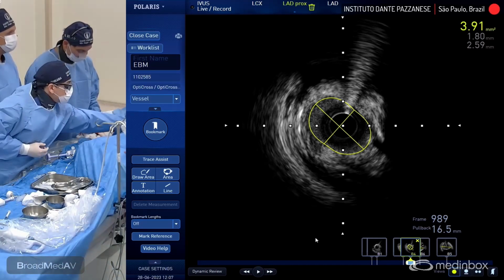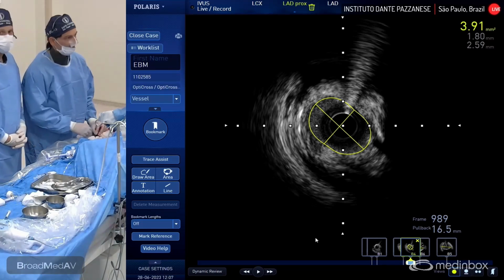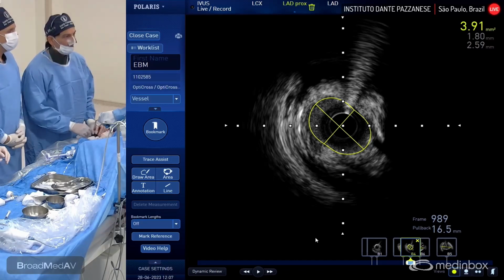into the side branch, even with an anchor, you can try a smaller balloon. You could do the anchor technique that you did here already. Can I have the angio, please? Now I will in screen.